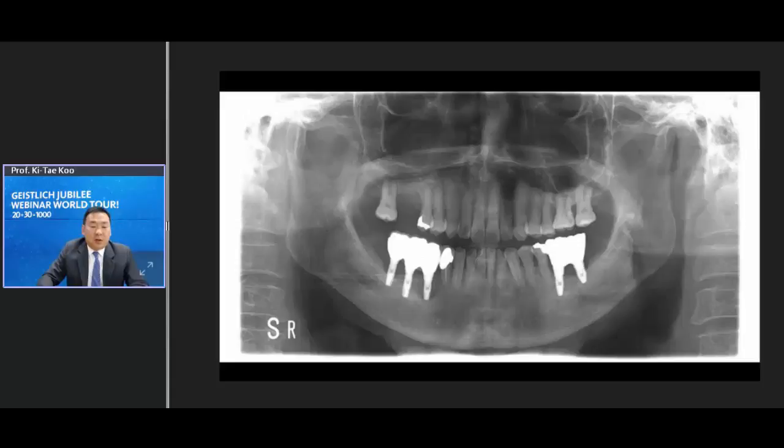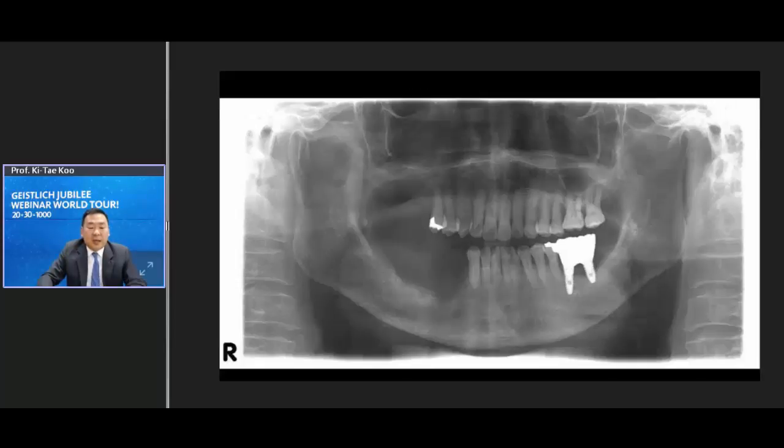I'd like to share with you another case done by my resident. On the lower right, the mandibular right implants, they decided to explant the implants again and do a GBR 2 months later. I think it was wrong. They could have just done a periimplantitis surgery or removed the first implant only, but they decided to do it anyway. And this is what you get.